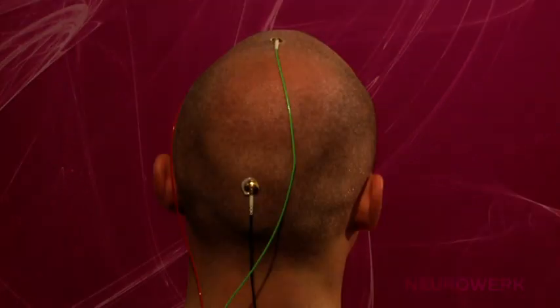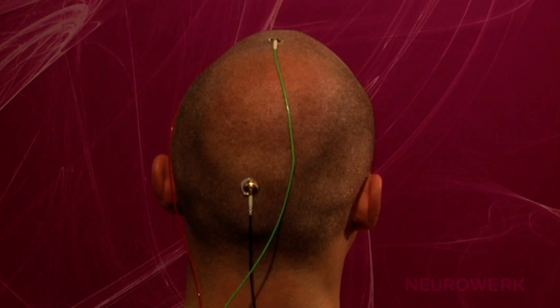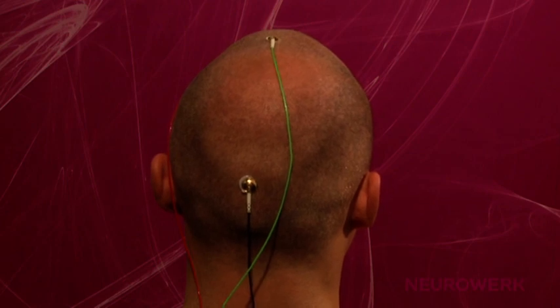The reference electrode is the electrode position FZ. The active recording place on the one-channel examination is the position located 3 to 5 cm above the inion that corresponds to the OZ electrode position. Surface electrodes are used for recording, and these are attached to the corresponding positions by using adhesive paste.